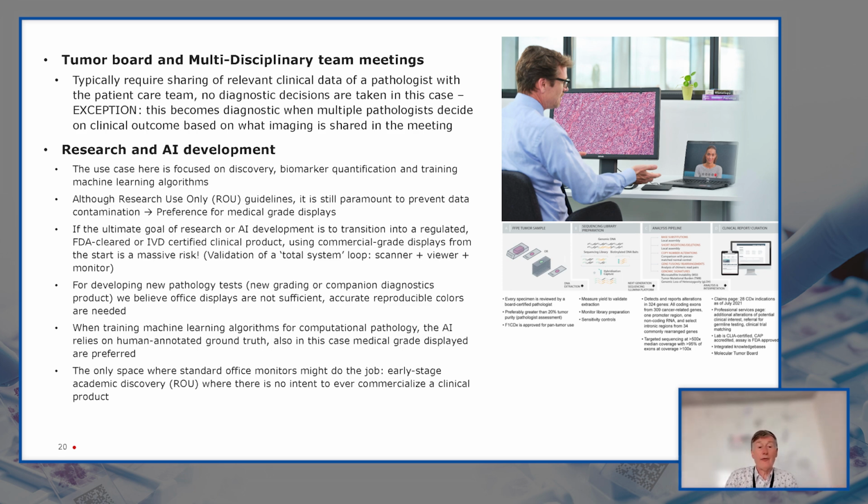Looking at the area of research and AI development, which is pretty broad. It could be discovery, it could be drug discovery or development, biomarker quantification. So there we see that in a lot of cases, CROs, they really focus on research and they really want to reduce the risk. So they really prefer already to use medical grade displays, especially if they are doing some work and they want to do a clinical validation later on.